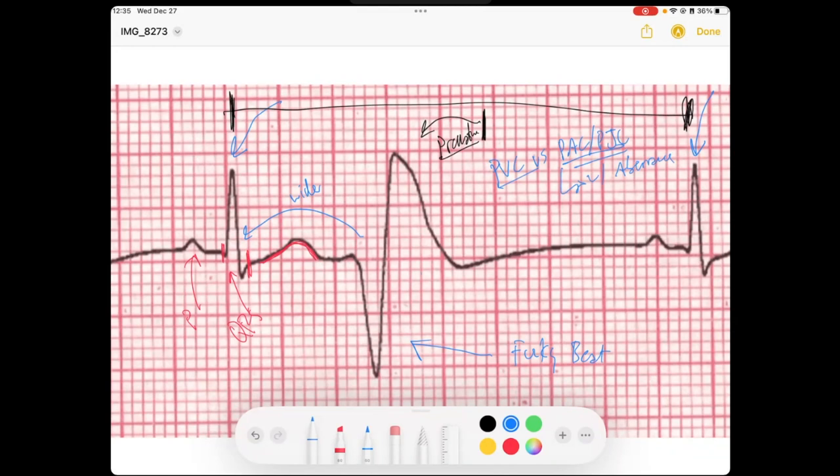So how do I determine the difference? Well, I look in front of this QRS. So I look here. So I see no P's.